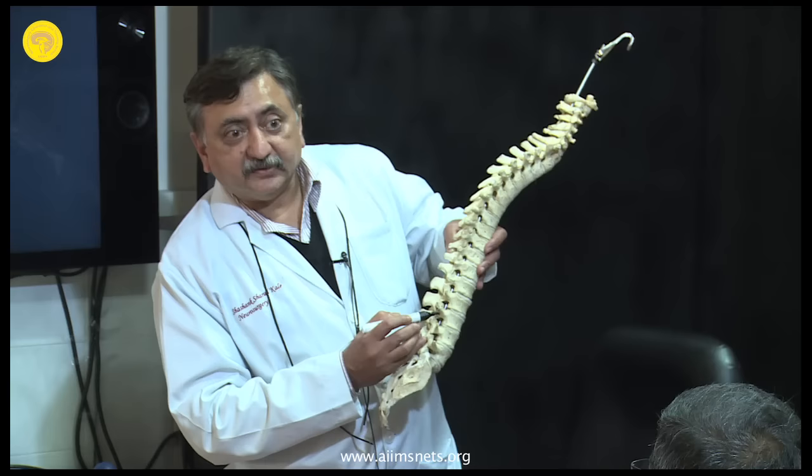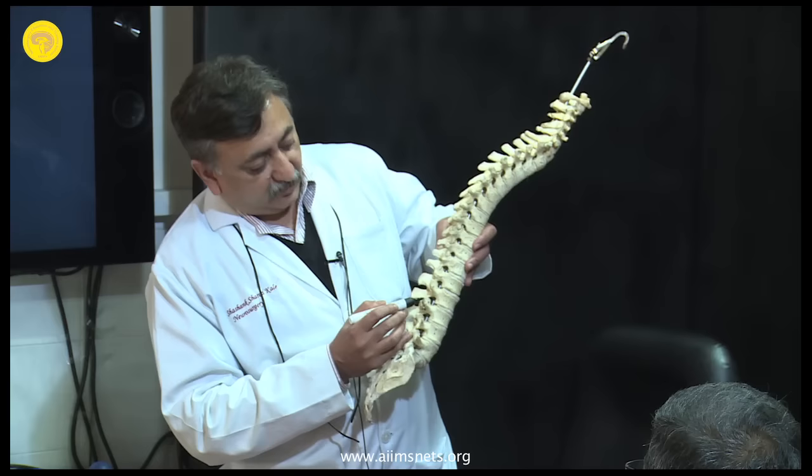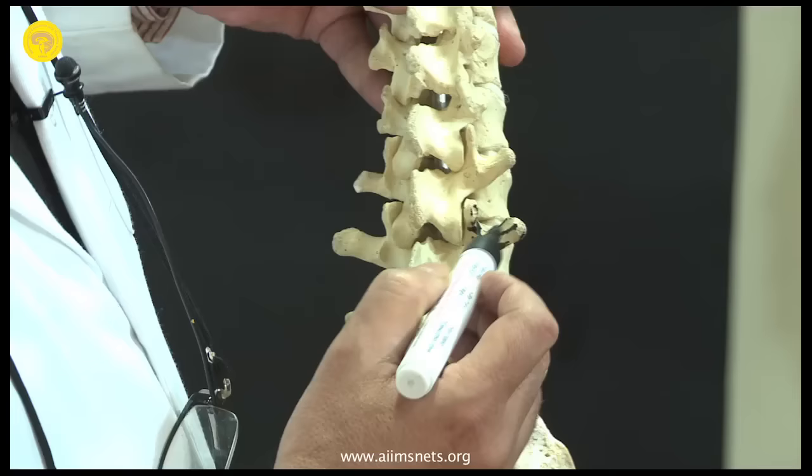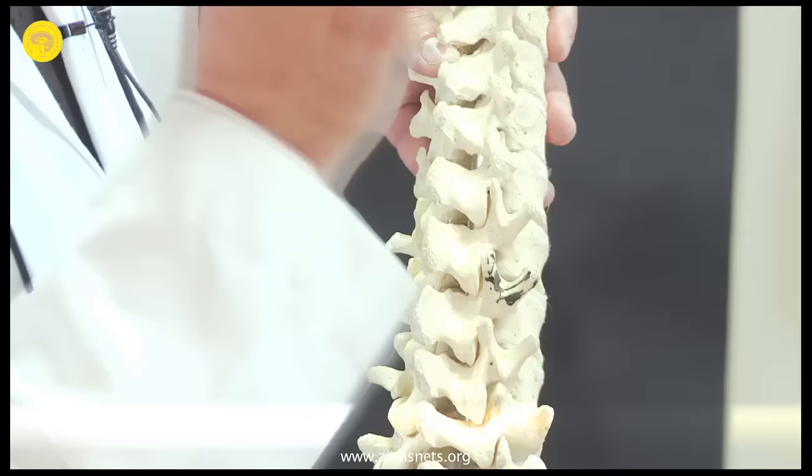Identify the whole articulating facet. Draw a line, imagine that, or you can use a cautery, a monopolar cautery, and draw that line on the bone, and draw the horizontal line, and then see where they intersect and use that point as an entry point. That's where you need to start.